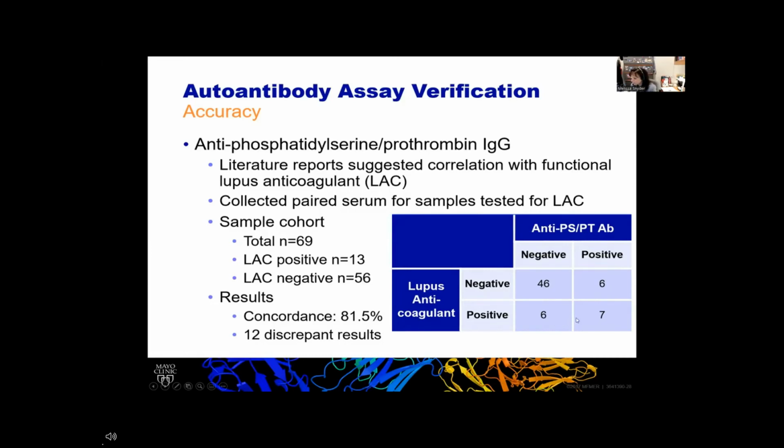Now, I will say that we did try to investigate these discrepancies, but it became very difficult. Number one, it's difficult because the lupus anticoagulant testing, there are a lot of subtleties to that. And we were relying on the coagulation specialists to help us make these interpretations on the lupus anticoagulant, whether overall they thought there was enough evidence to support the presence of this functional testing.